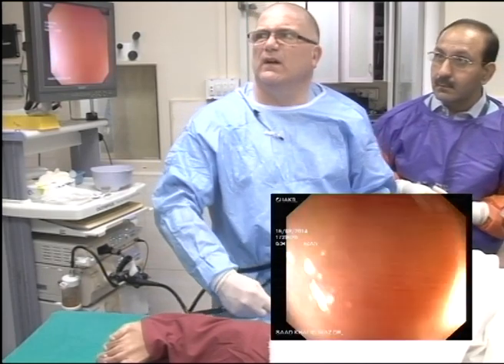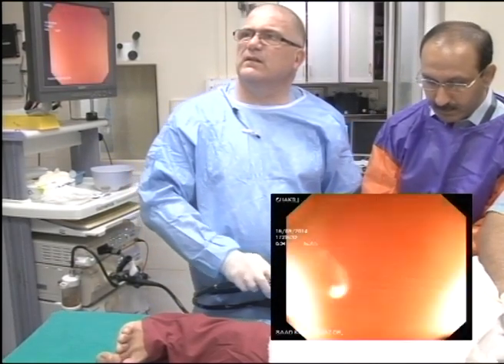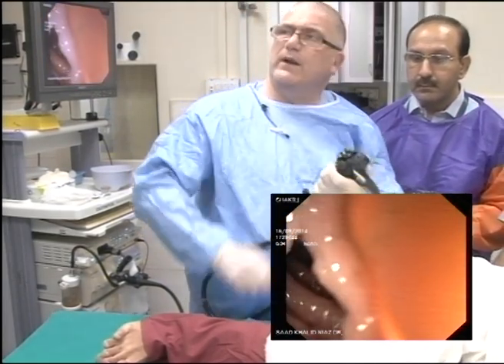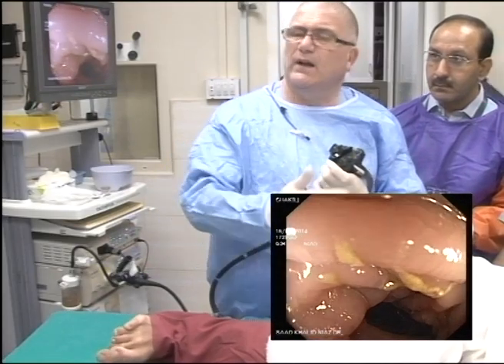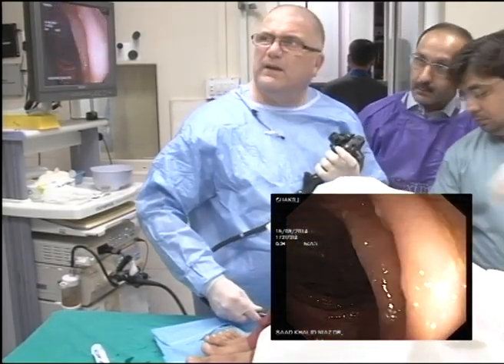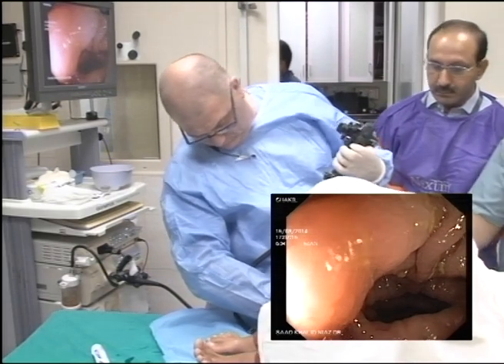Now I've chosen to do that because you've gone in at an angle that's causing the scope to feel a little bit rigid. And then we'll come off there, so we take that out, and then the scope will sit central to the lumen. So we've got little wheel neutral, this time the big wheel is back, so as we draw back, the scope will neutralise and then can go forward. Okay? So if he comes onto his back, watch what happens to the scope as he comes onto his back. All we're doing is keeping it central, and then we draw back, suck, suck, suck, come back, suck, and then go forward. That's fine.